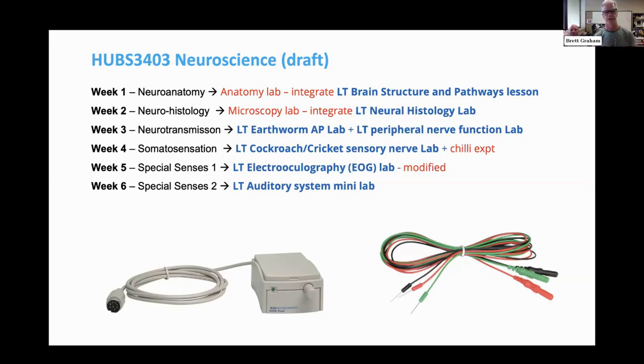So the pod was obviously essential. It is an accessory that you may have to buy extra if you don't have it already. But setting up the electrodes was even easier than what Brian demonstrated for the VEPs, the visually evoked potentials, because they're all at the front here. Really what they're doing is capturing the extraocular muscle movements, and so it really does give you quite a nice and demonstrable, I would say foolproof, fail-safe, whatever way you want to put it, option of detecting eye movements, which is just fantastic to demonstrate that close association with the vestibular system.